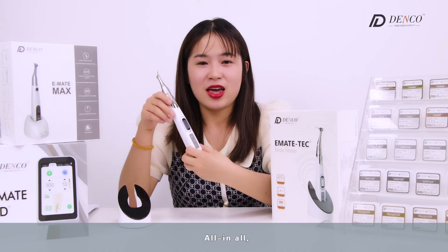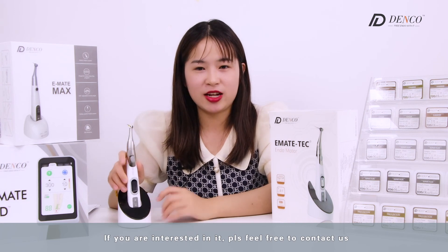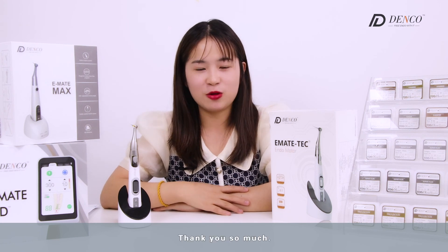All in all, Emate-Tec is specially tailored for the dentist. If you are interested in it, please feel free to contact us and more information will reach you. Thank you so much.